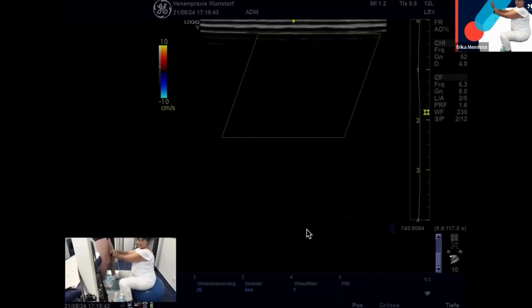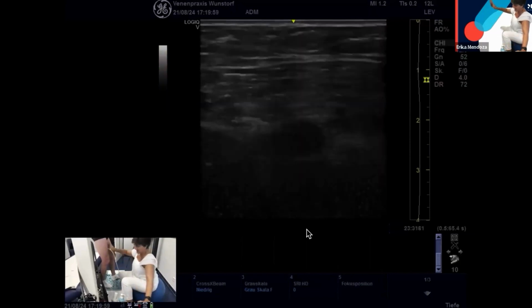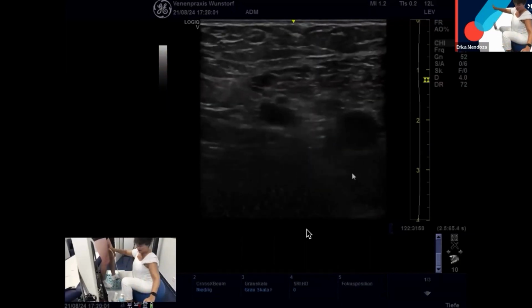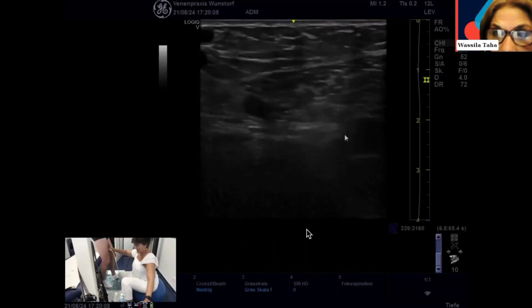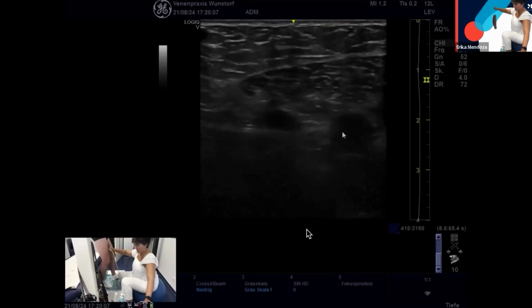And between this point and this point, we have a diastolic reflux, but it is going upstairs. So it comes out here, it goes out here, and it goes right in through the perforating vein. Is it clear to everybody? You mean it's a closed circuit? It's superficial to the superficial?